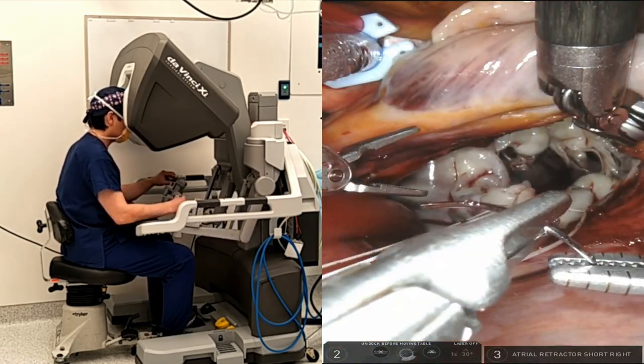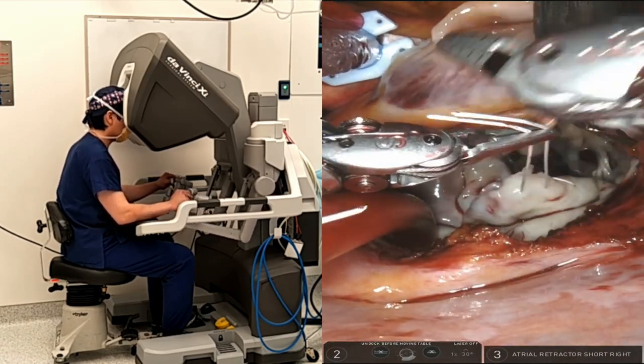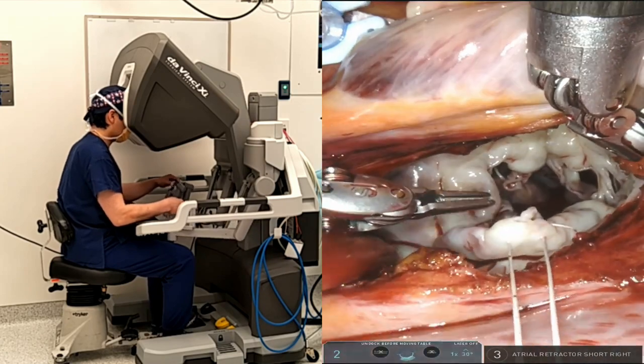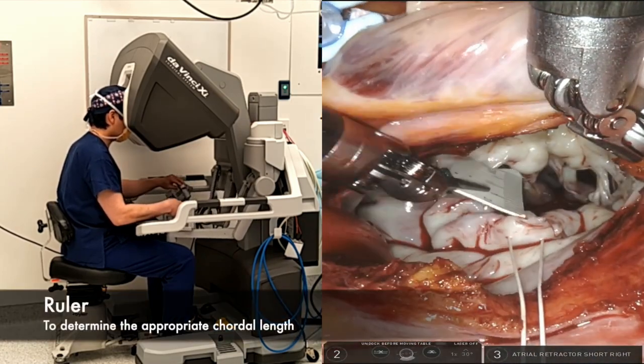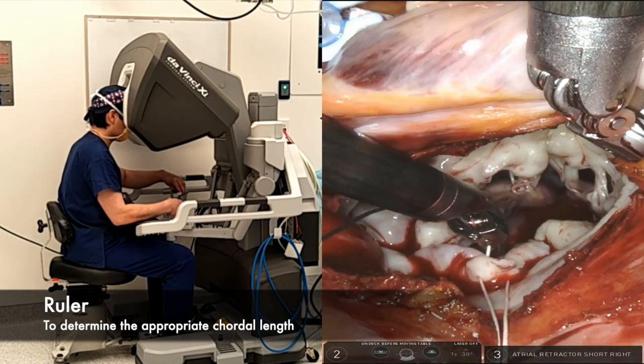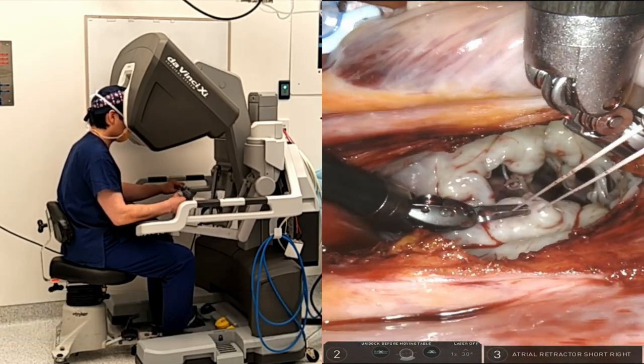Step 2: I use a pre-made ruler on the back bench that is cut to the exact length according to the normal cordal length measured by my anesthetist on the pre-operative transesophageal echo. Once the ruler is positioned between the papillary muscle and the free edge, you can adjust the height of the leaflet accordingly.